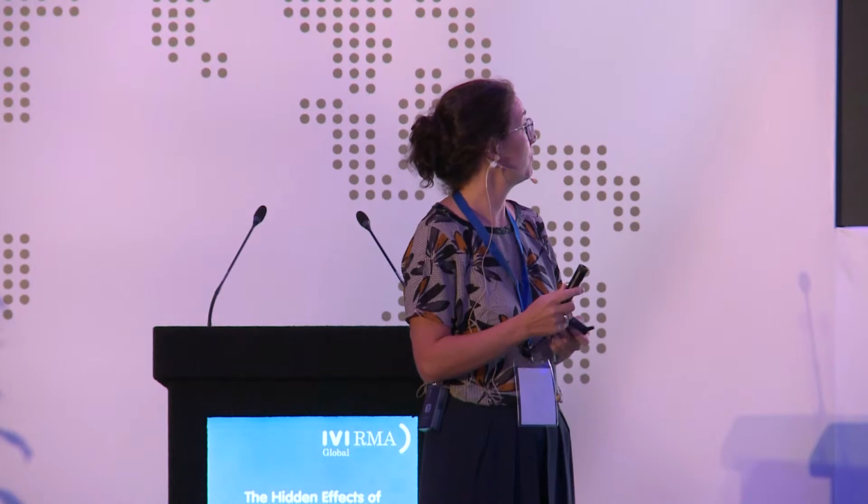Then for the cortical granules, here you see a fresh oocyte and a vitrified oocyte. In a fresh oocyte, normally you see a rim of cortical granules present in the subcortical region, while after vitrification the amount and the density are much lower. For this reason, and because of the effect on the microvilli, it is advised to perform ICSI after oocyte vitrification rather than IVF.